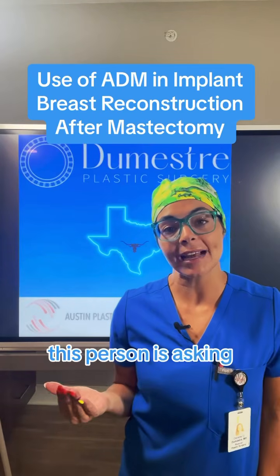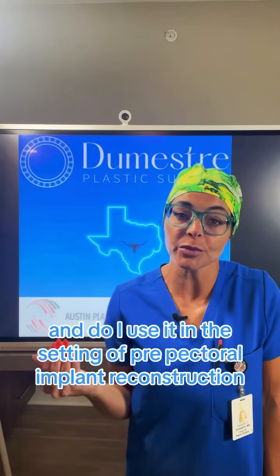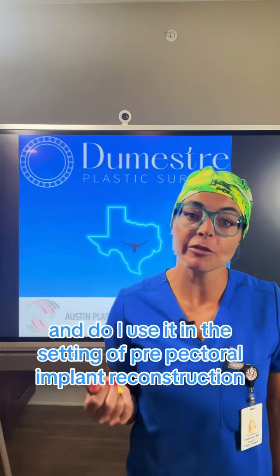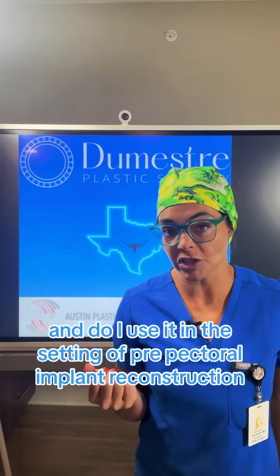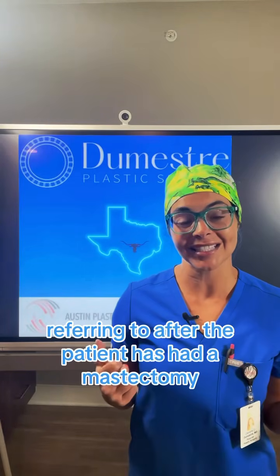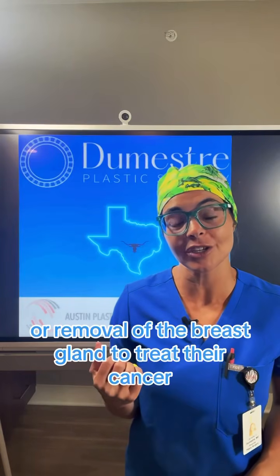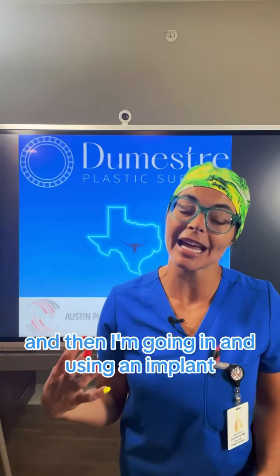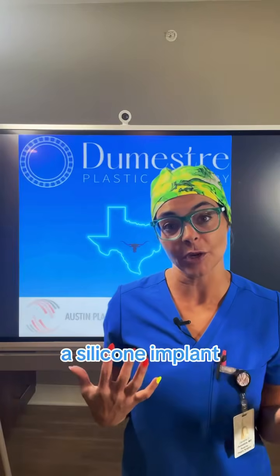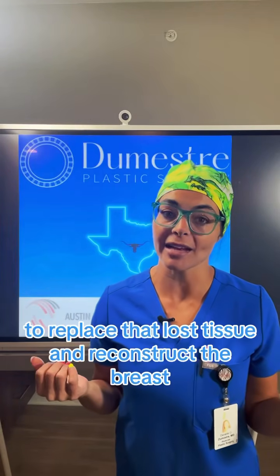So this person is asking, what is the purpose of ADM and do I use it in the setting of prepectoral implant reconstruction? So breast reconstruction referring to after the patient has had a mastectomy, or removal of the breast gland to treat their cancer, and then I'm going in and using an implant, a silicone implant, to replace that lost tissue and reconstruct the breast.